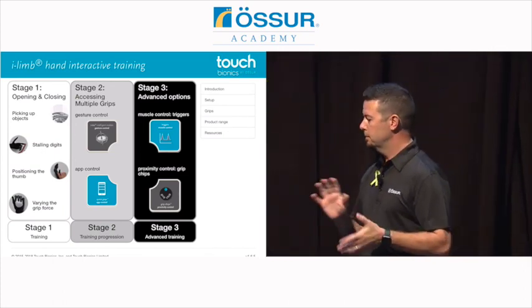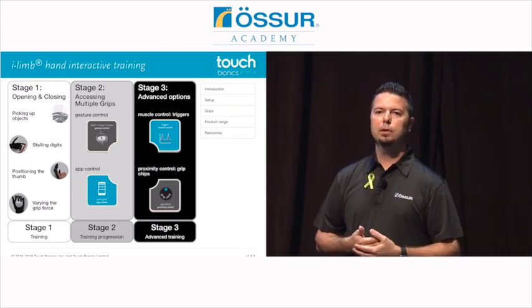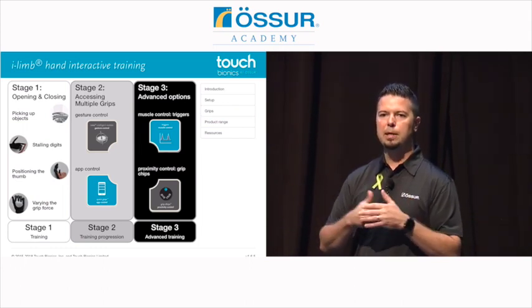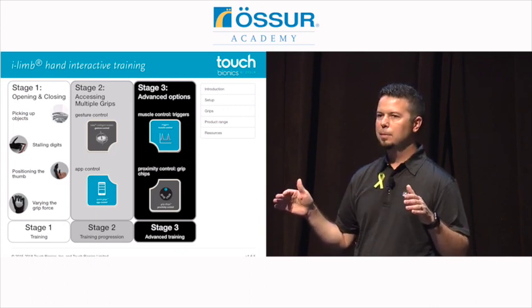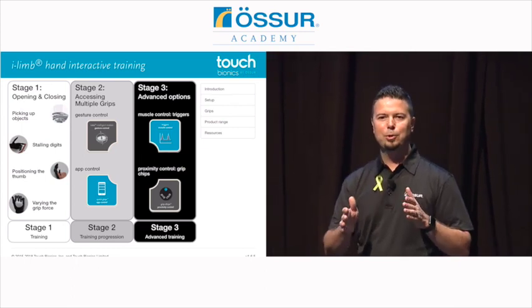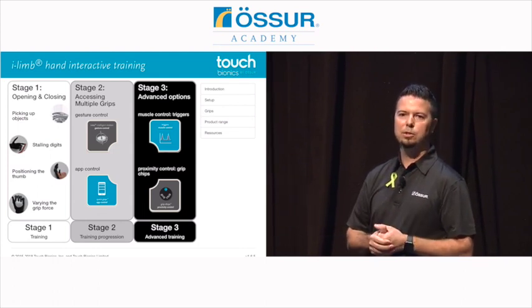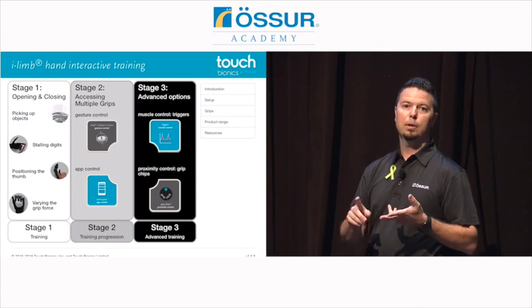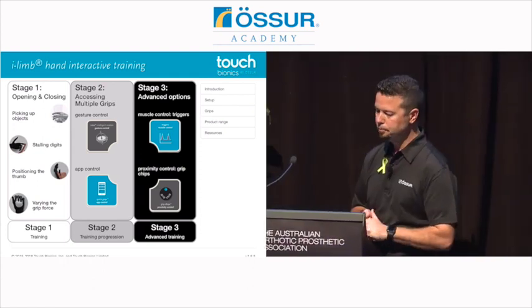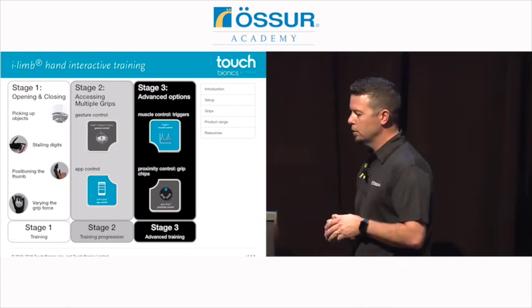Once you click on either one of those, you're going to be greeted with this staged training approach. With new and advanced technology, it's really important to introduce things in stages. For those of you maybe my age who grew up watching Karate Kid, Mr. Miyagi taught Daniel to wax on, wax off before he fought. It's the same sort of approach. There are some basic fundamental things that a user has to master before you introduce the more advanced technology. Otherwise, you're going to either overwhelm them or it's just not going to sink in as well. So that's the staged training approach. And then on the right-hand side, there are some resources as well. We're going to start over there with the introduction.